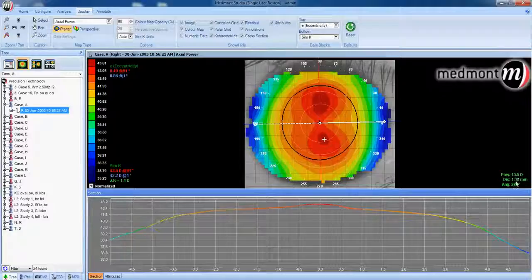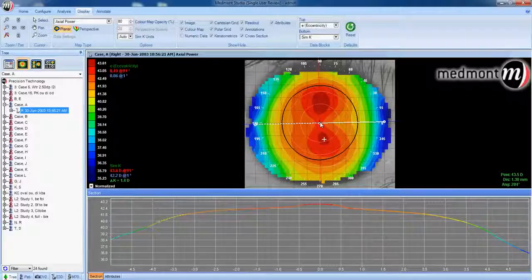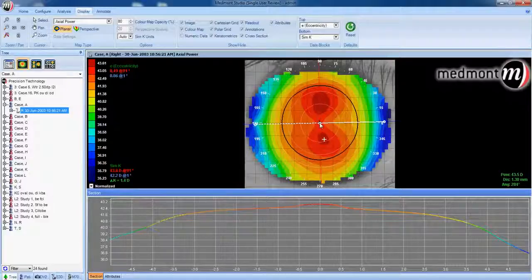Where the cursor has been clicked, we're 1.30 millimeters away from the center of the topography. The center of the topography would be the visual axis — the point the patient is fixating at the moment the map is taken.